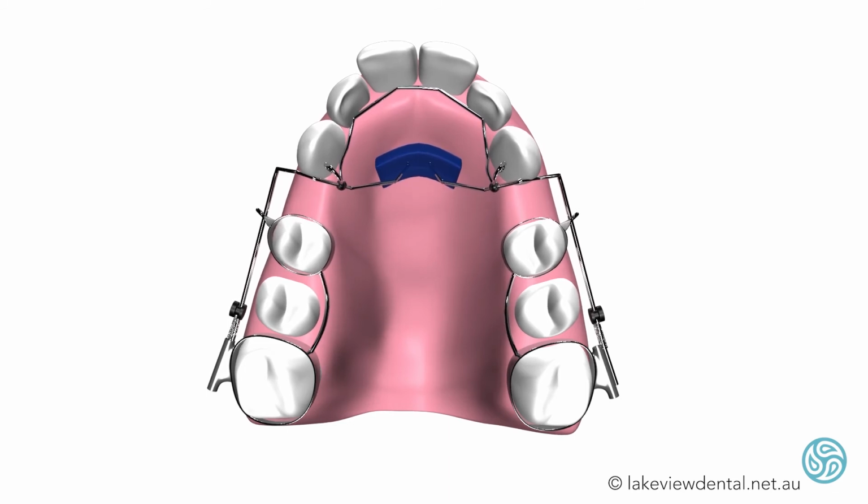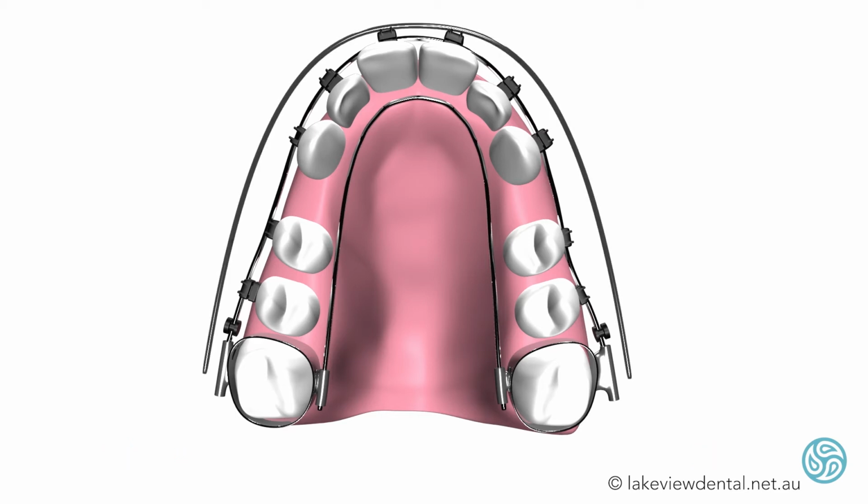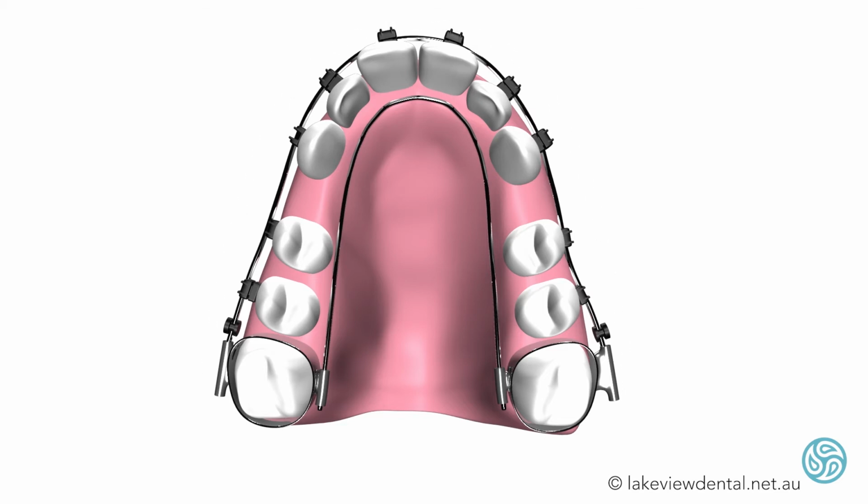When the required forward growth has been achieved, the appliance is removed and the next stage of controlled arches, braces, begins. A rigid wire called the Fixed Removable Lingual Arch, or FRLA, is placed in the roof of the mouth attached to the molar teeth. This wire is pre-adjusted to allow for the right width of the palate, as well as to have an effect on possible canting of the teeth. A light force wire is placed on the outside of the teeth, attached to the orthodontic brackets. Both these wires have the effect of developing the arch.